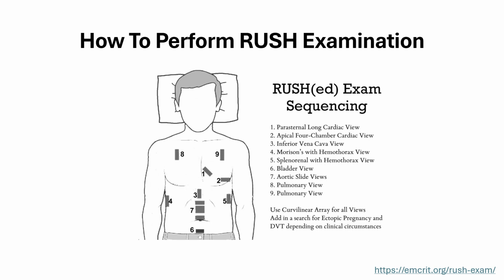And linear probe, because of its higher and superior resolution, is usually better for lung ultrasound exam for pneumothorax detection. Please take a moment to review this slide.